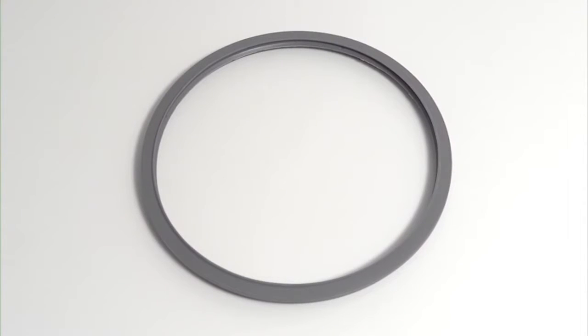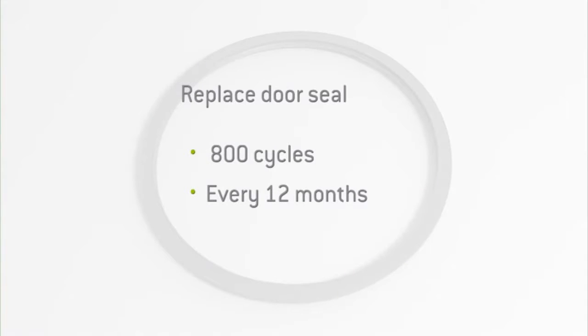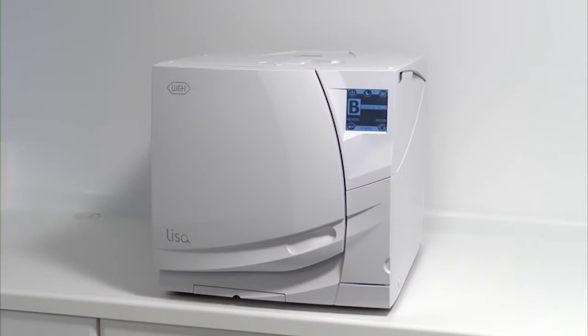The door seal should be replaced at regular intervals of 800 cycles or every 12 months, whichever is sooner. By replacing the door seal, you ensure your steriliser continues to have a hermetic seal, essential for correct operation and minimising cycle failures.